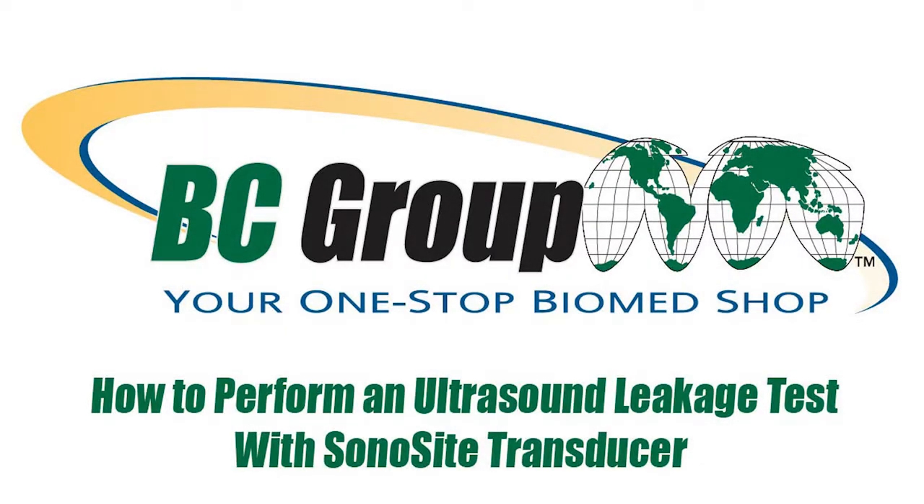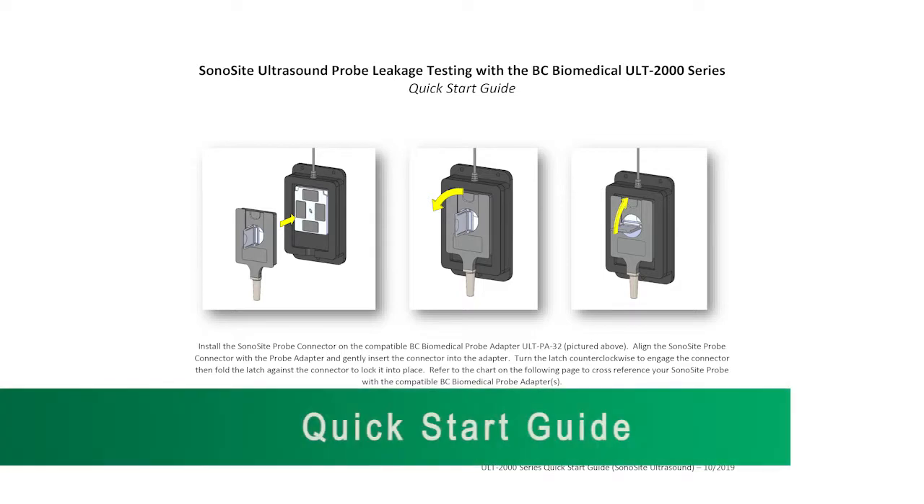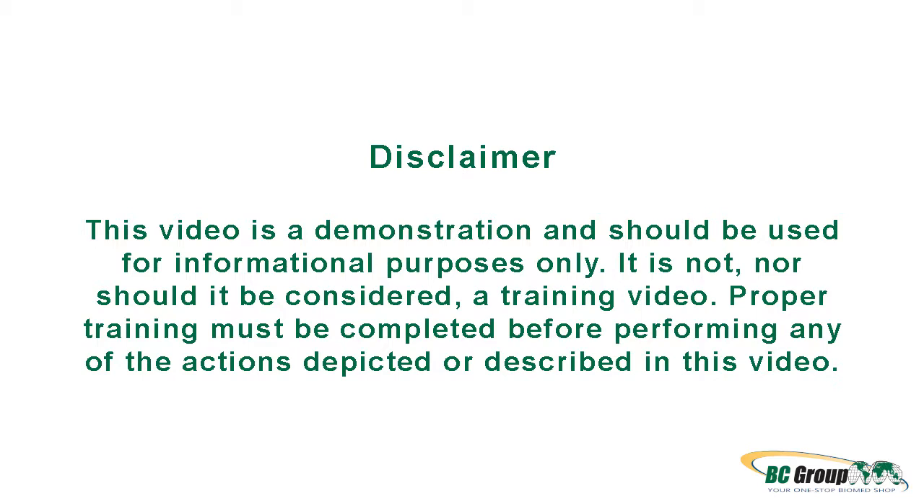How to Perform an Ultrasound Leakage Test with a SonoSite Transducer. Prior to testing, please review the Quick Start Guide: SonoSite Ultrasound Probe Leakage Testing with the BC Biomedical ULT 2000 Series. This video is a demonstration and should be used for informational purposes only. It is not, nor should it be considered, a training video. Proper training must be completed before performing any of the actions depicted or described in this video.